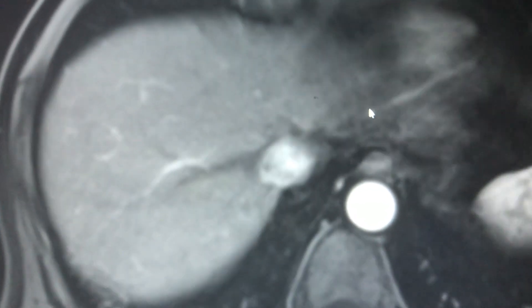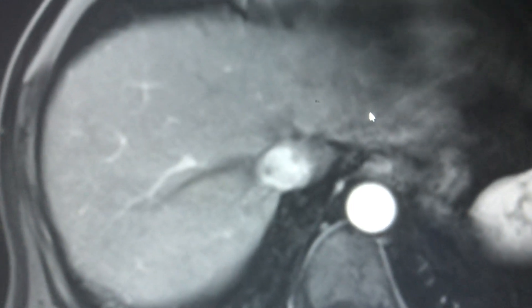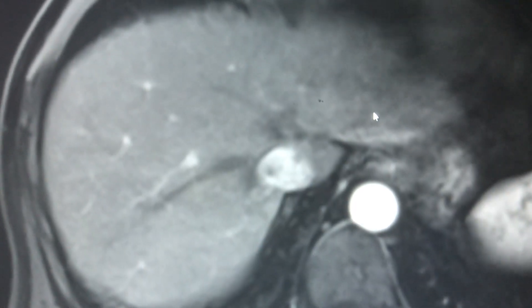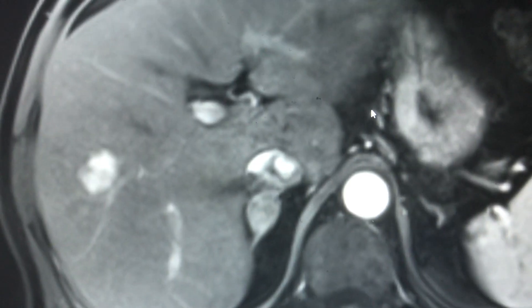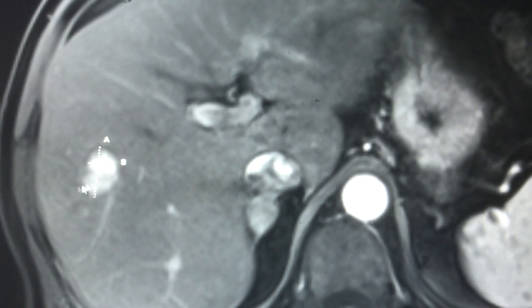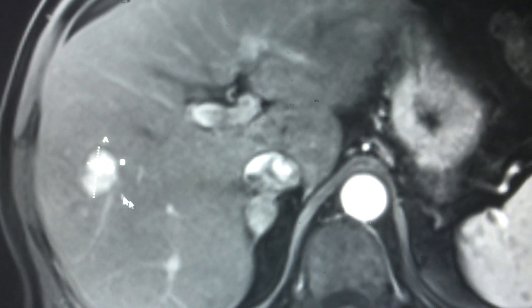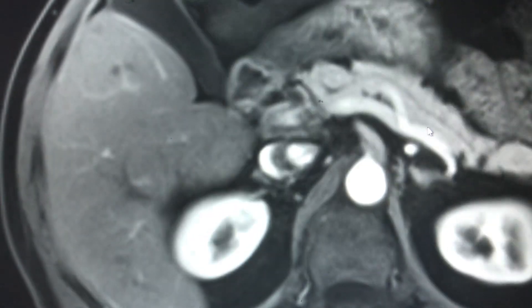This is a 58-year-old patient with a history of hepatitis C, which was previously treated. However, the patient subsequently developed liver cancer, which is this tumor here, which shows up on the arterial phase of this MRI.